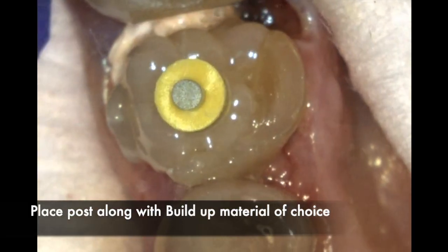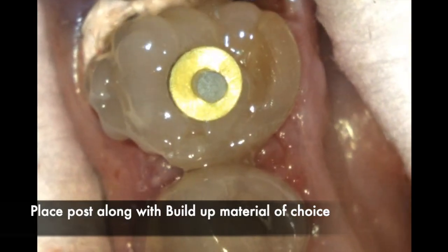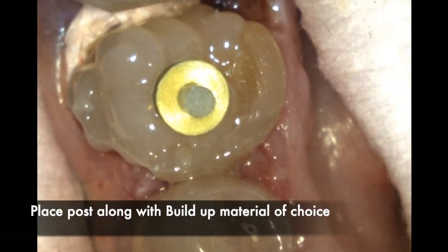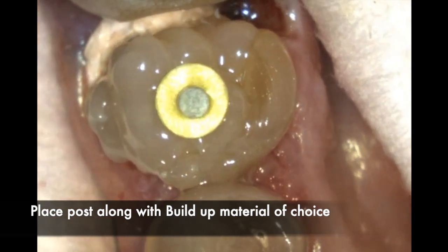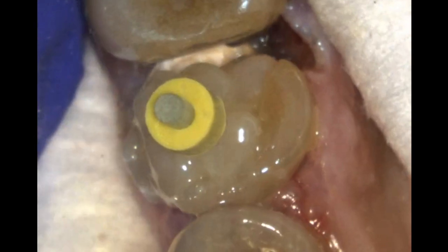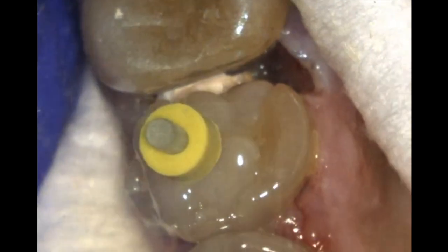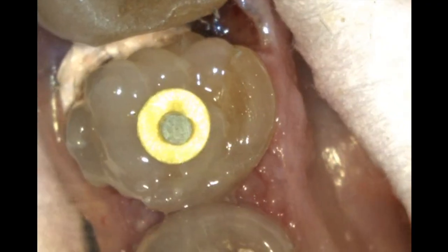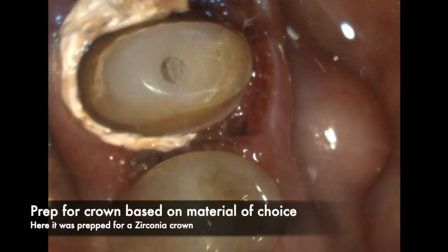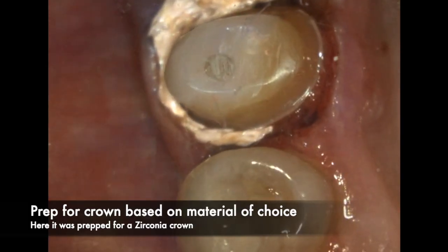Once that is done, go ahead and do your bonding process, use the buildup material of your choice, put the post into the post base, and stack the buildup. One tip: over-build — don't be skimpy on the buildup material. Try to over-build as much as possible so you can prepare an ideal crown and are not hampered by lack of buildup material.